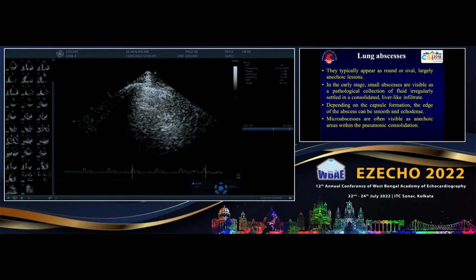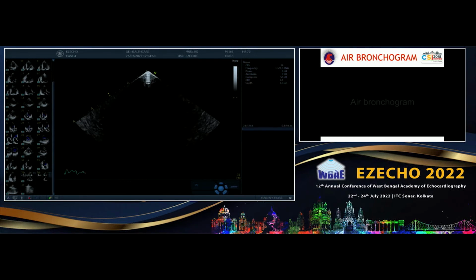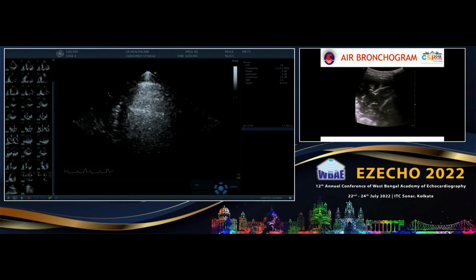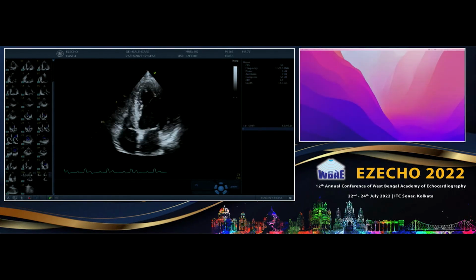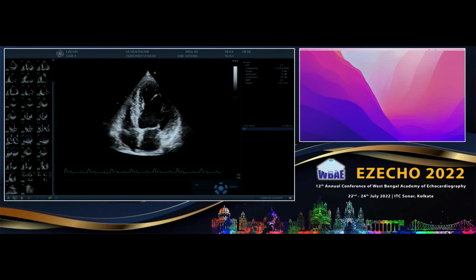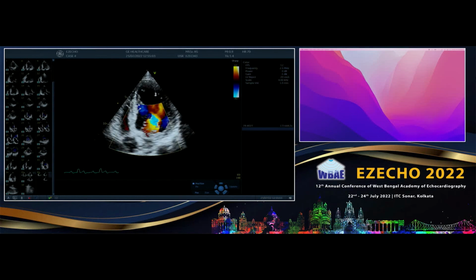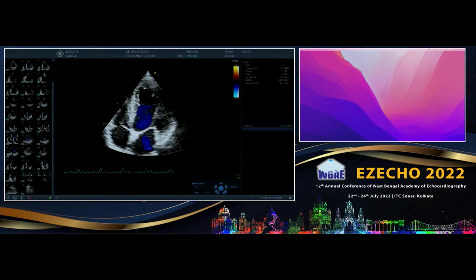Now, there was a question asked: in atrial fibrillation, RV pacing, LBBB, how do you know the diastolic dysfunction? So, let us start with atrial fibrillation. The first important thing is that atrial fibrillation occurs because of left atrial fibrosis. Left atrial fibrosis occurs definitely because of a lot of comorbidities which are affecting the myocardium.